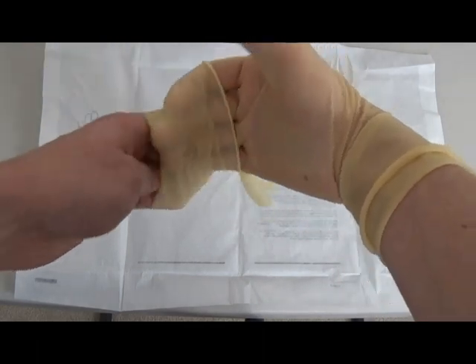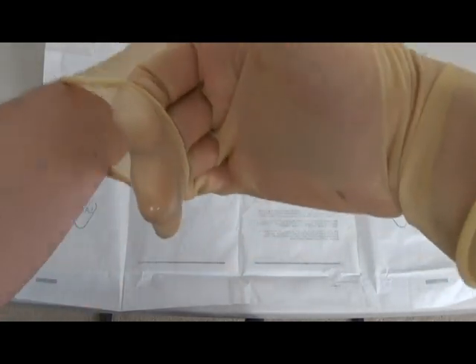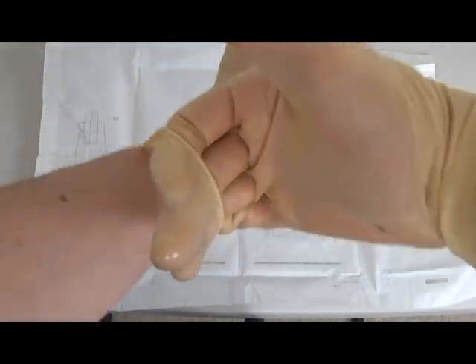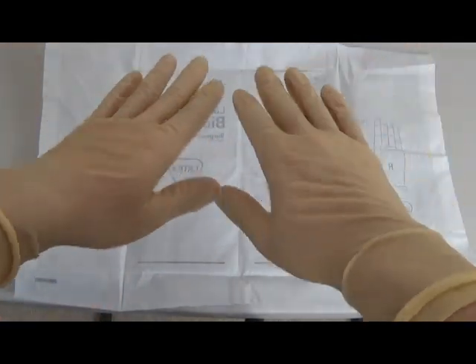So now it's going to go in. And as you go in, just stay away from your arm as you put it on. See how I'm doing that? Stay away and just let it go. Once it's on, you're sterile and you're good to go.